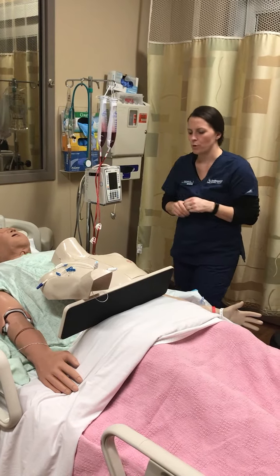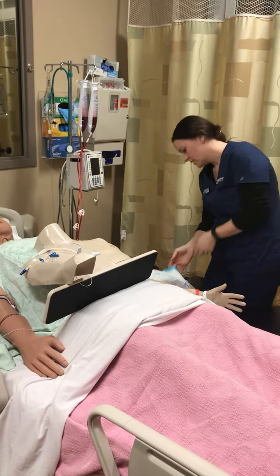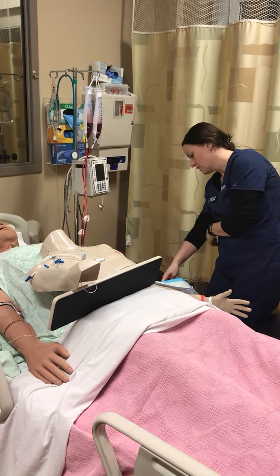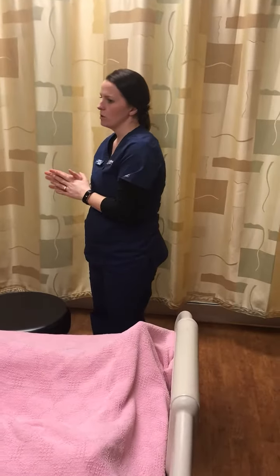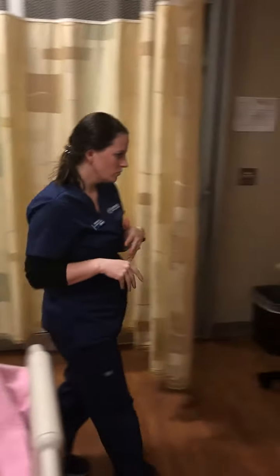She says she's allergic to morphine. Okay, that's good to know. We're not too concerned about that. Can you go ahead and tell me your name and date of birth, please? And so she tells me her name and date of birth. Okay, perfect. I'm going to go get my equipment ready and all my supplies so we can go ahead and get that medication to you.